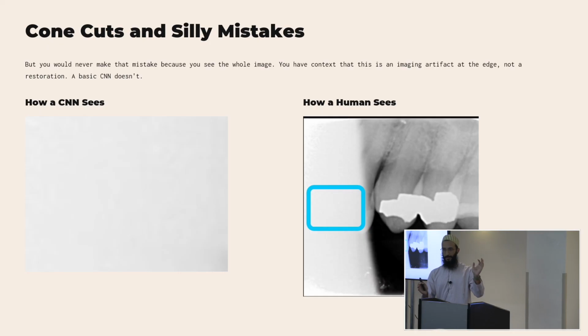I talked about ChatGPT a little bit. What's interesting about those models is that they have a lot more context. We can talk a little bit more about how that might evolve in the future. But at current state of the art for dental radiographs, they're trained like this, and they have this fundamental limitation. So if you are a company or whoever trying to make dental AI work, what do you do?